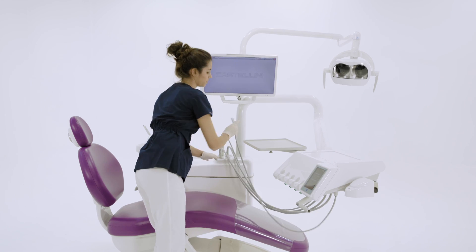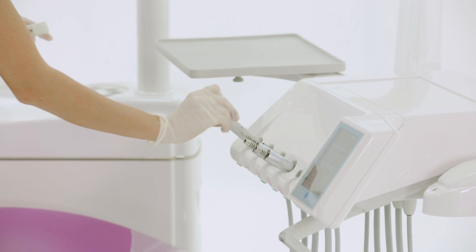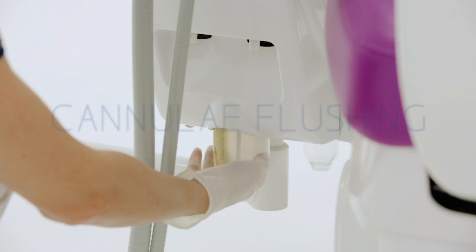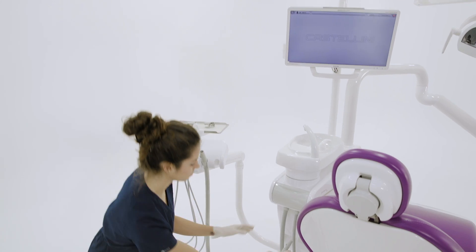When the time flushing cycle finishes, the assistant takes the instruments from the tub and places them back in the dentist's module. To activate cannula flushing, the assistant places the suction hoses in their special holders.